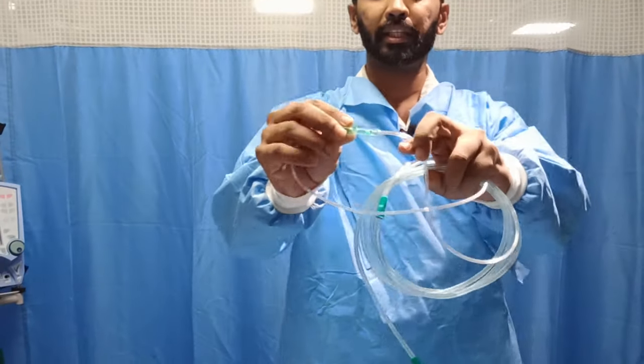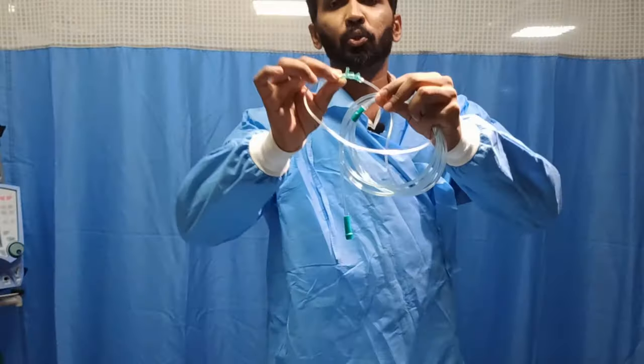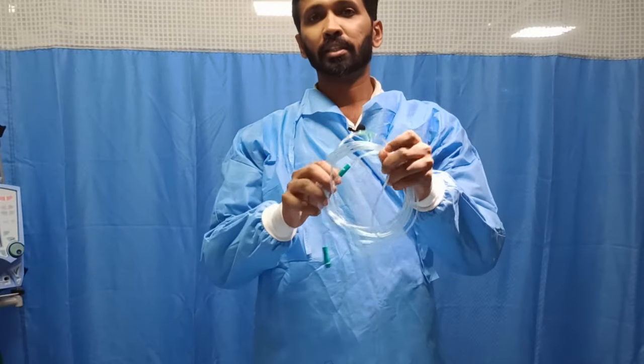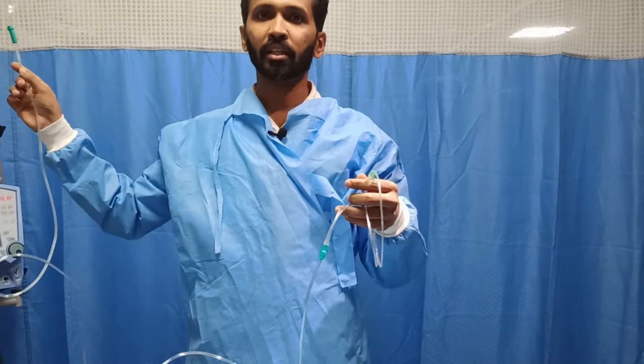Okay, first of all, the basic low flow oxygen device that we use is the nasal prongs. How do nasal prongs look? This is the nasal prongs, you can see like this. The nasal prongs are connected to the patient's nostrils and to our central flow meter.